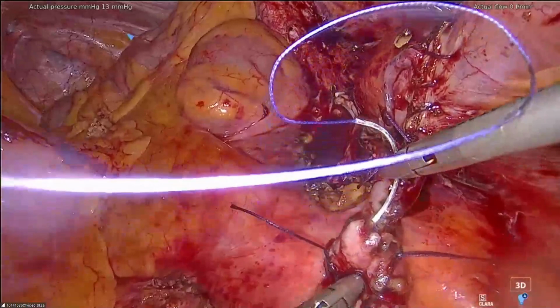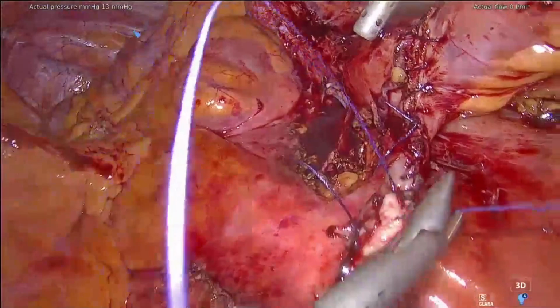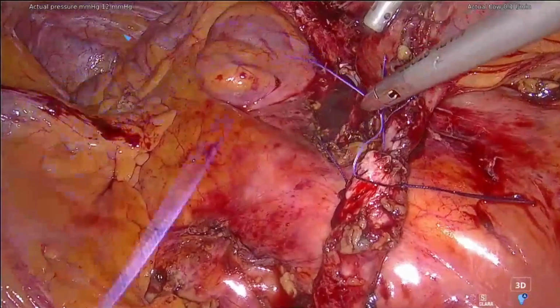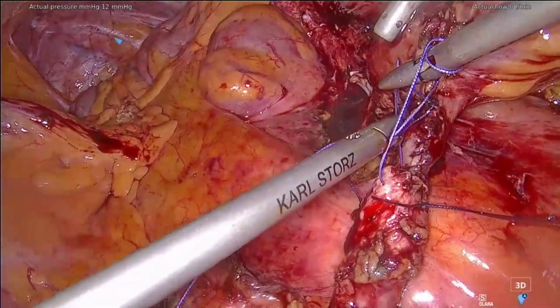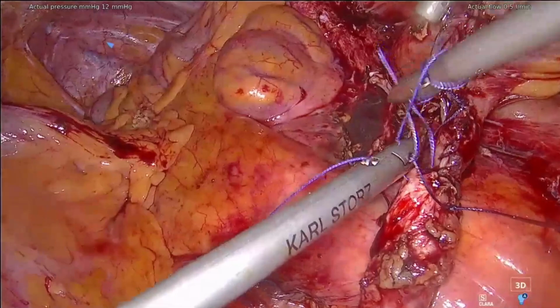Yeah. But you are right, I was jumping too fast between the two stitches here. I see that. But I have to be careful. At one moment, we have to stop and just drain through the natural urinary tract. And then after, the tissue will meet the water tightness, the complete water tightness. It's the reason why we leave the catheter and everything so long.